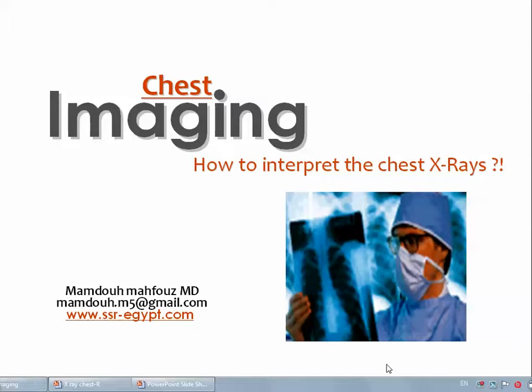Now let's start the sector of chest imaging, and it contains about 11 lectures. We will cover through these lectures most of the issues concerning thoracic pathology. And we start with one of the most important lectures at all in the radiology specialty, which is how to interpret the chest x-rays.